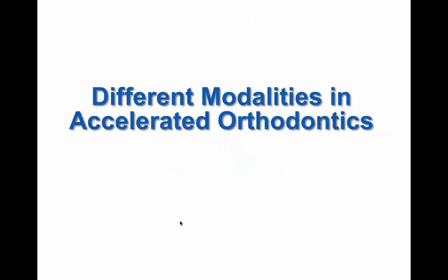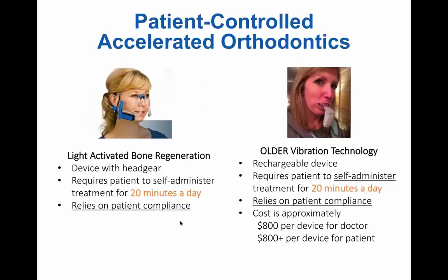So let's take a look now at modalities in accelerated orthodontics. And by the way, this modality can be applied throughout the arch, whether you want to focus on specific stubborn teeth or if you want to focus throughout the arch in helping all the teeth move more rapidly throughout treatment. So there are some other different techniques that have been attempted and used in the past. The one on the left I've not used before.